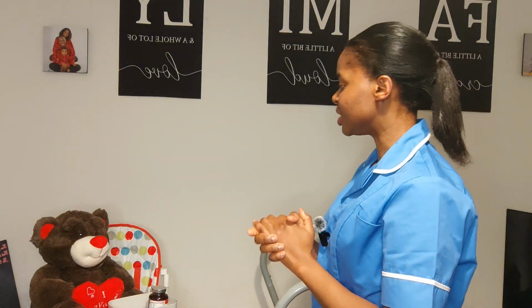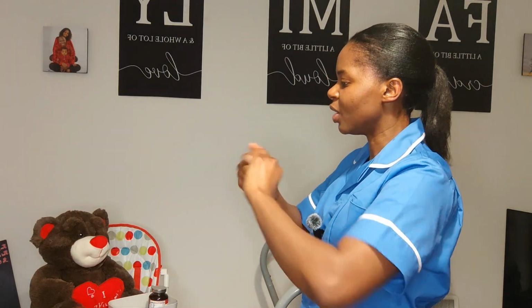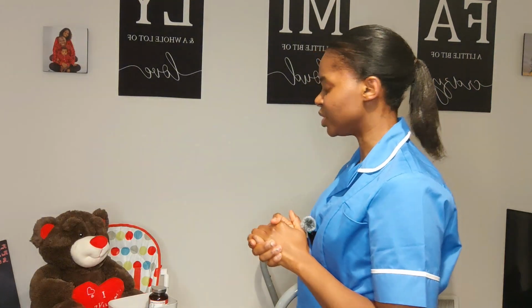As I approach my scene, I see my scene is safe, nothing to harm me or my patient. I provide privacy by pulling the nearby curtain. I go ahead to perform my hand hygiene, following the 7 steps of WHO standard. Ample amount of gel to my palm, I rub palm to palm, right palm over left dorsum, vice versa. Fingers interlaced, fingers interlocked, vice versa. Rotational rubbing of the thumb, vice versa. Rotational rubbing of the fingers close to my palm, vice versa. Rotational rubbing of my wrist, vice versa.